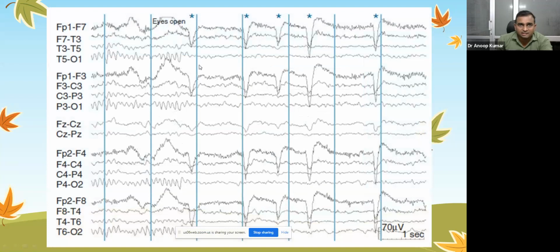So this is an EEG tracing which is clearly depicting the eye blink artifacts. We can see the eye blink artifact mainly in the frontal leads. This is FP1, F7, FP1, F3. Then we can see them on the left side, and there are right side blink artifacts. There are lots of artifacts. There is no periodicity. This is at the will of the patient.